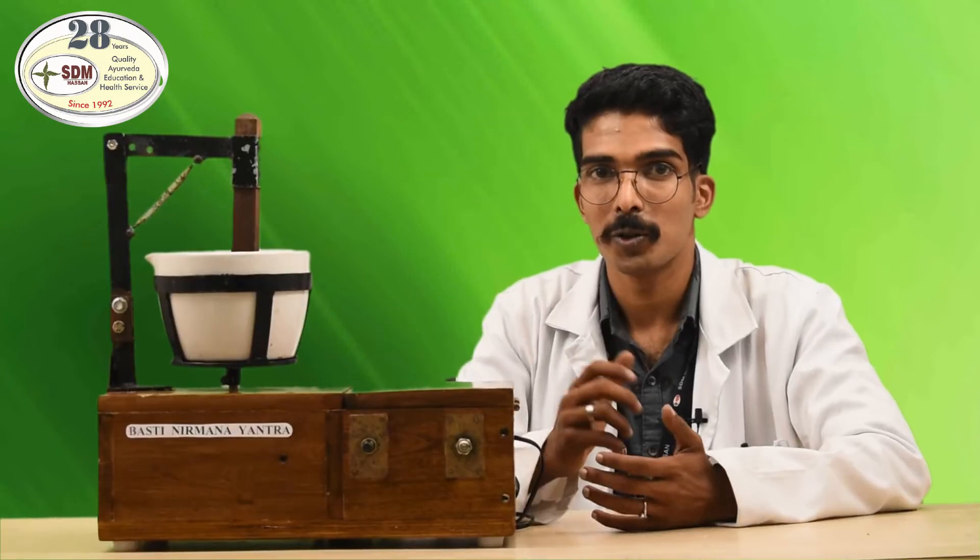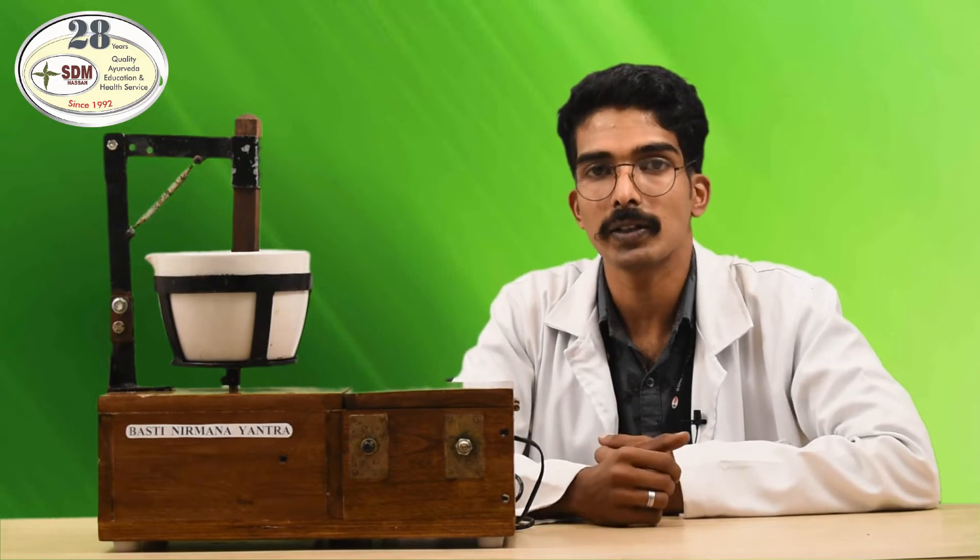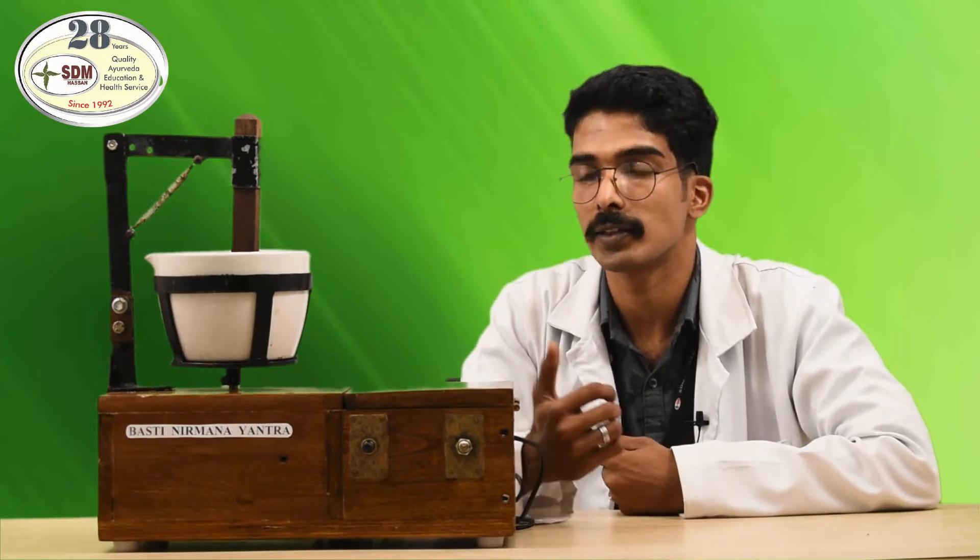Today, I am going to demonstrate one of the instruments that I created for study. Today, I am going to demonstrate the Bhasti Nirmana Yantra. This instrument will make Bhasti preparation very fast and spontaneous in the classic method.